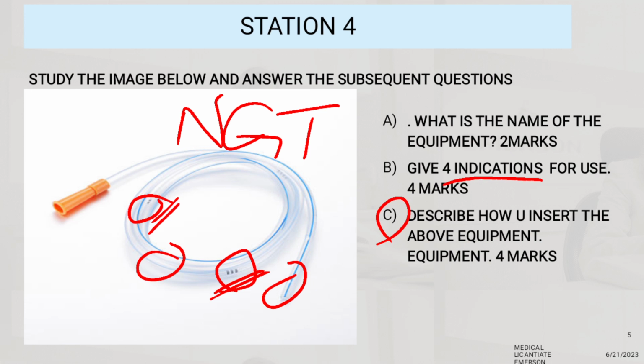You can also try to aspirate. There are a lot of ways to check for proper tube placement. So we will make another case study on that part, how to check for proper tube placement of the NG tube.